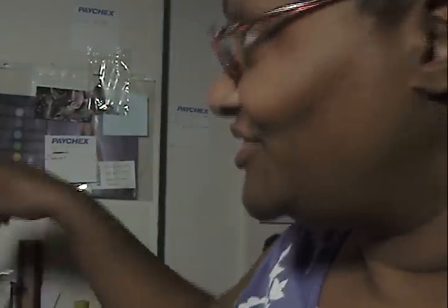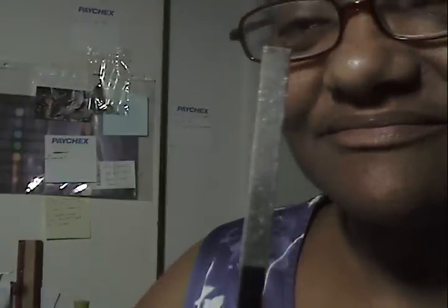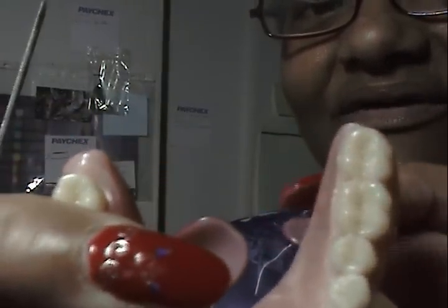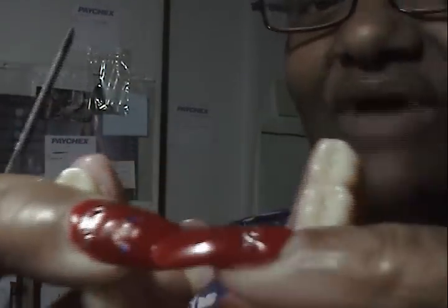So today, well, I started with my emery board just to be safe. And it felt better, it felt better, it felt better. And I thought that wasn't feeling good enough, fast enough. So then I took my diamond head. And I'm just going really soft and slow on the inside of my mouth to get that blunt part right here on the inside of my mouth to not be blunt. So I'm filing and filing and filing up and down in circular motions.